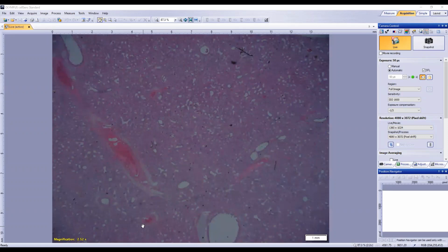So someone run us through what microanatomic structures we're going to mentally or actually examine in some sort of order. The order doesn't matter as much at this point. So run us through the microanatomy of what we're working through.